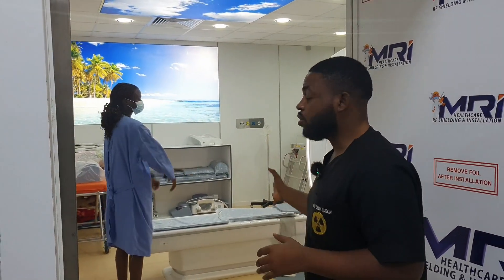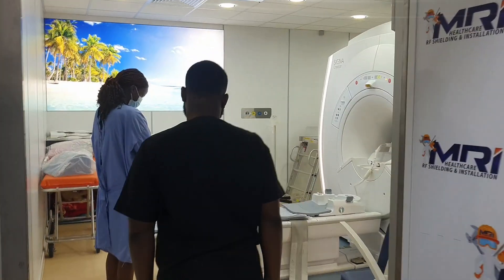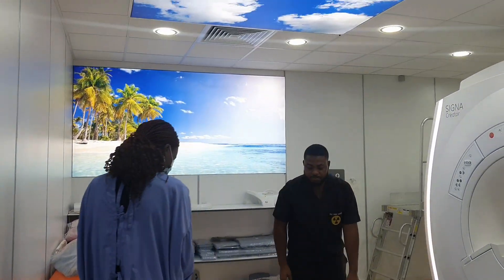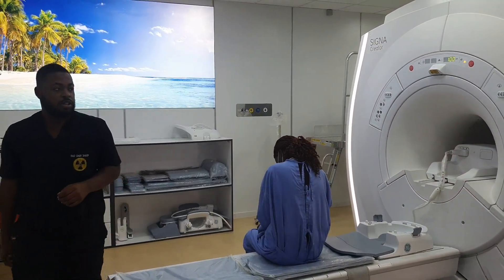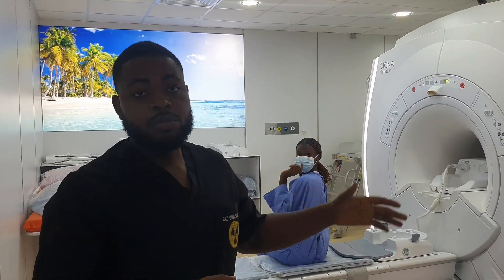So I'm going to position her right now. I'm going to take off the mic because it's not really going to work in there. As we all know, MRIs can always make a very loud noise, so I'm going to put in some earpiece for her to help reduce the noise. And I'm going to connect it to the music player out there to play some music while we're doing the examination.